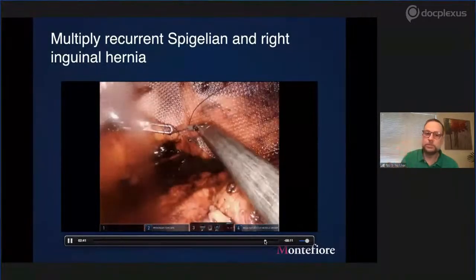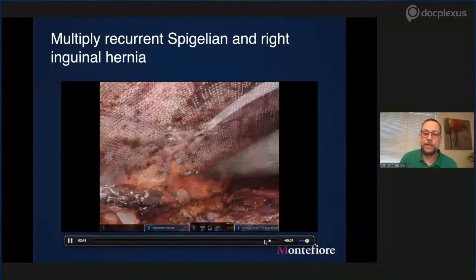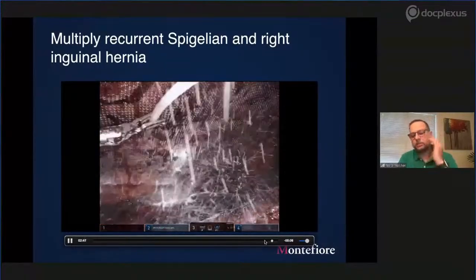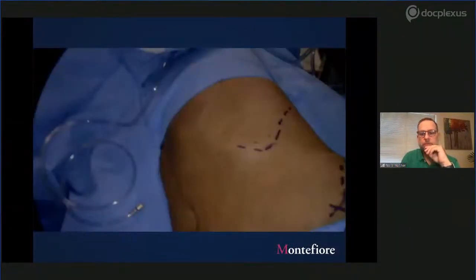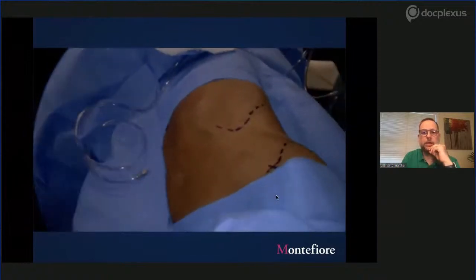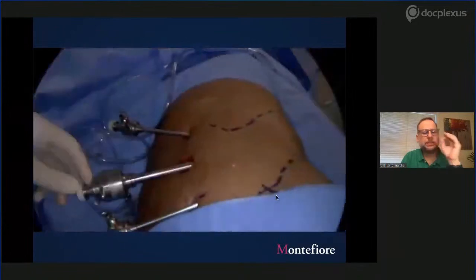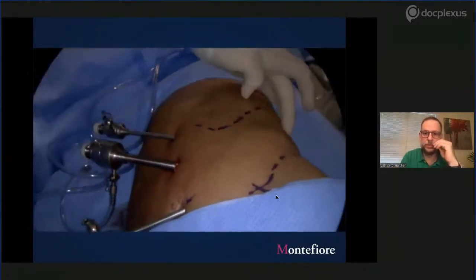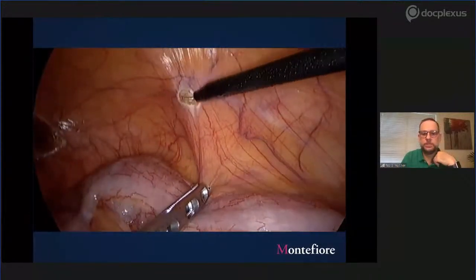Posteriorly, you can use some glue fixation. He's tying to the Cooper's ligament, and that's the mesh, a pretty open, wide mesh cover. And he likes Arista for hemostasis and seroma prevention. And to finish this, I want to show another case from Cristiano, just again off midline, a primary lumbar hernia, a Grynfeltt hernia. I think those cases are great for transperitoneal repair or a total extraperitoneal repair, but I think the transperitoneal is easier to accomplish.